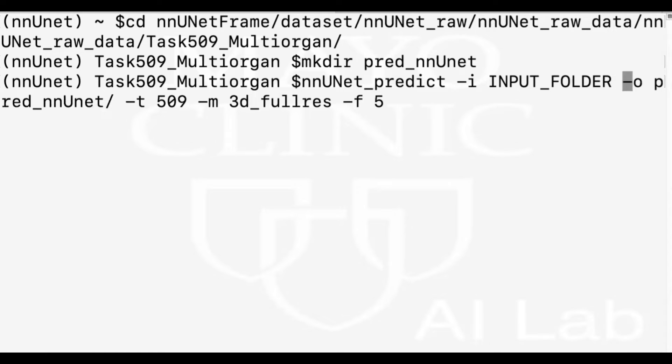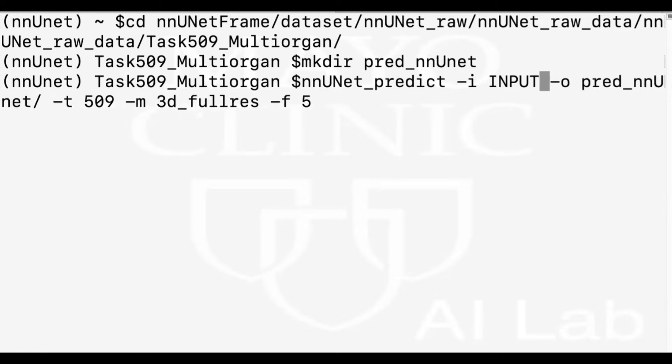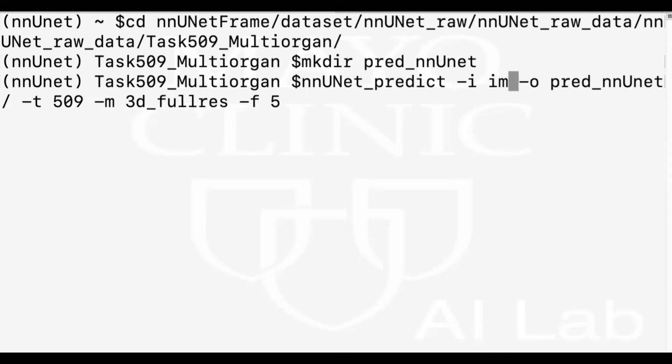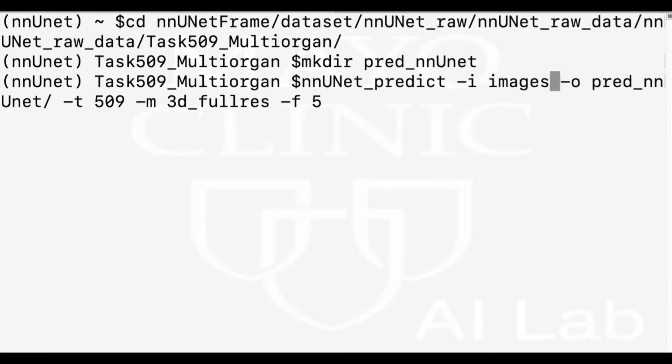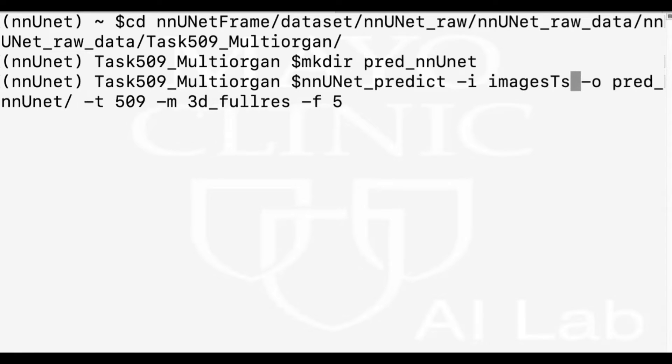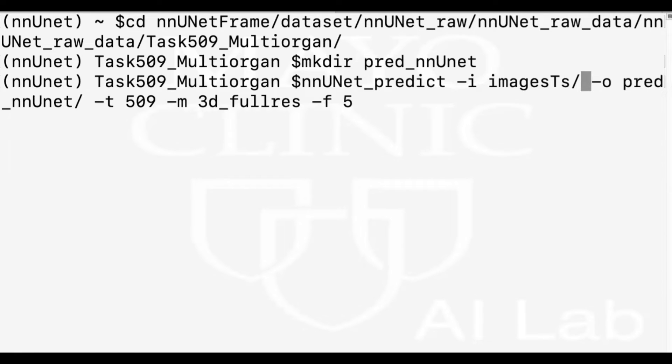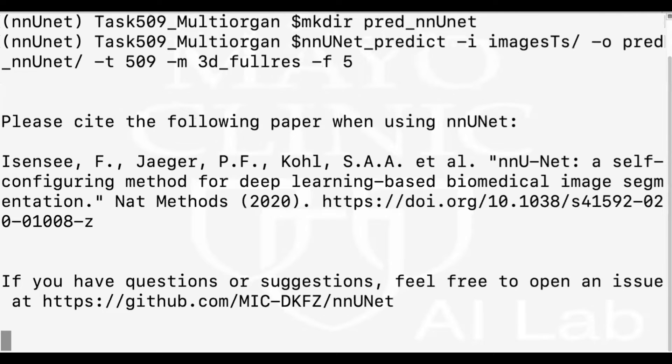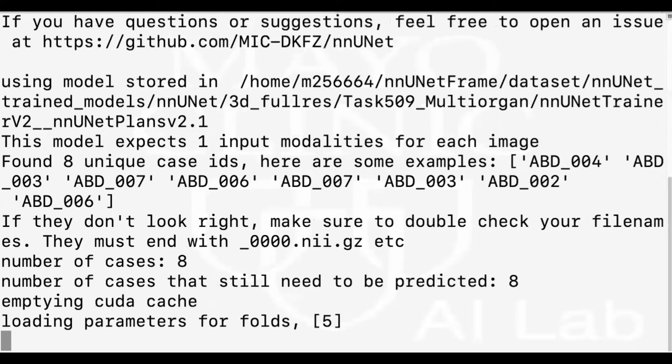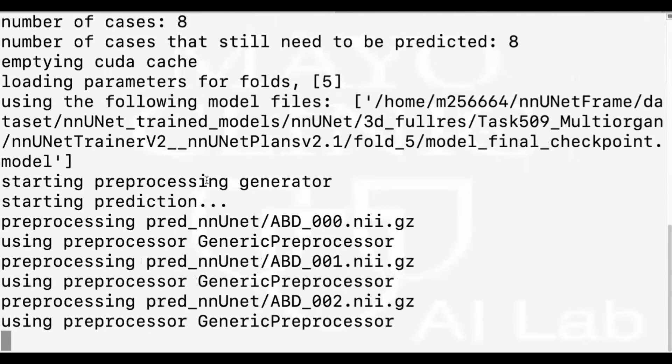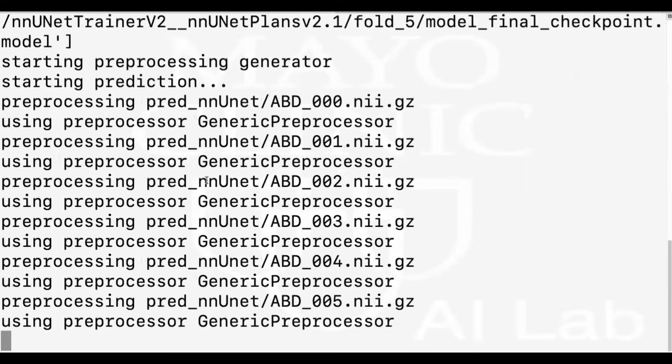And then input folder is images TS. Now everything is good to go. We press enter, run this command. As you see, it's loading the fold number 5 that I've trained and it's doing its job.